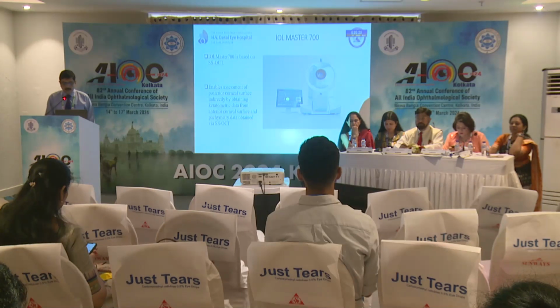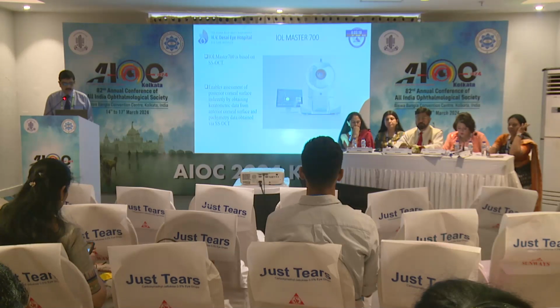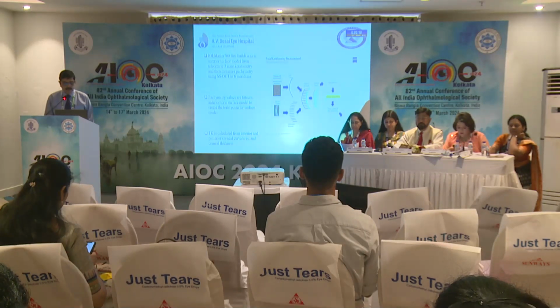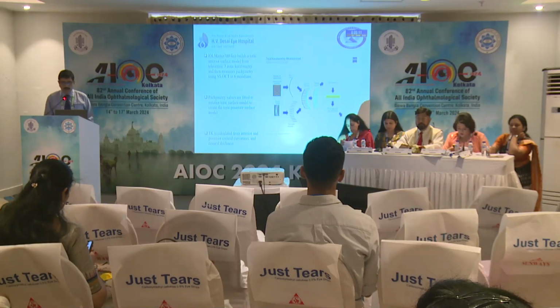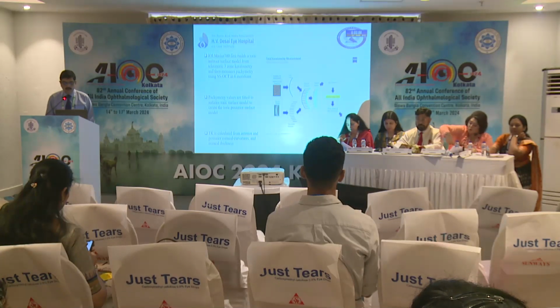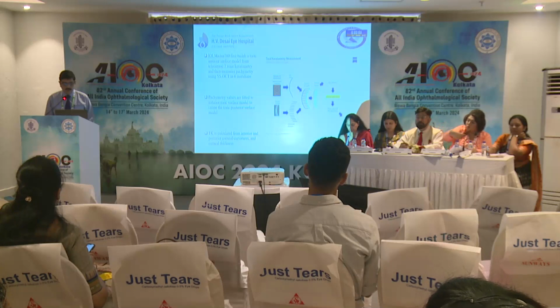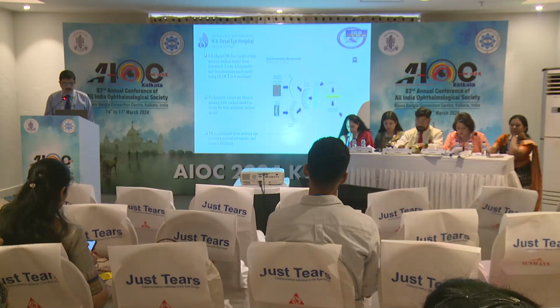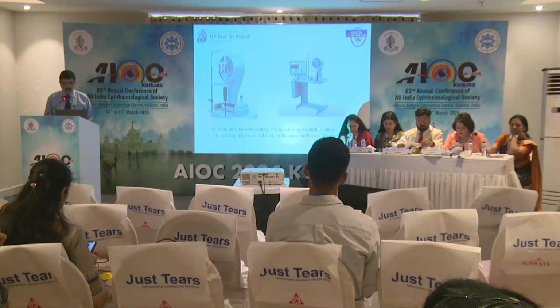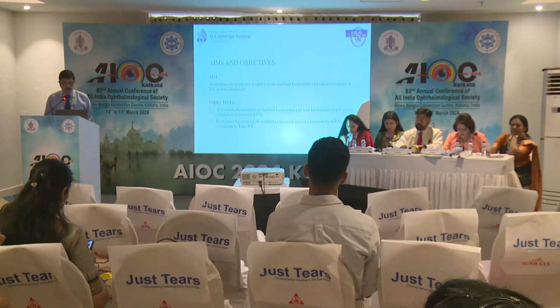The IOL Master 700 is a swept source OCT-based optical biometer which we used in this study. This machine first builds an anterior toric model with telecentric keratometry and then measures the pachymetry using swept source OCT. The pachymetric values are then fitted onto the anterior toric surface model to create a posterior toric surface model. Then total keratometry is calculated using the anterior and posterior corneal curvatures and the corneal thickness. Pentacam and Sirius also use Scheimpflug imaging for measuring the posterior corneal curvature.